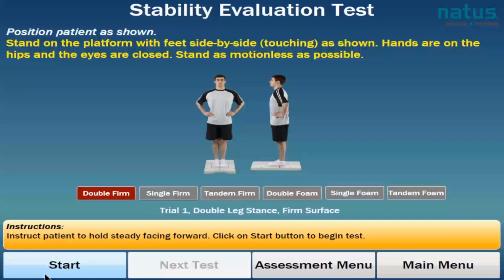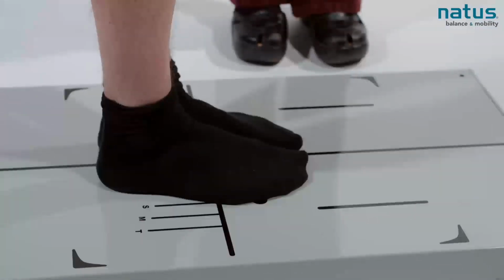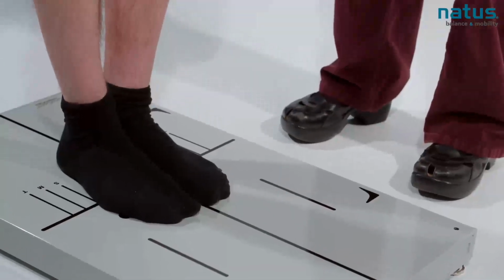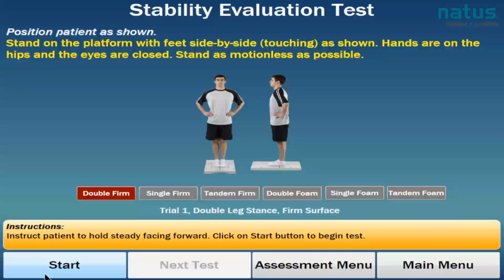And now we are ready to start the SET protocol. What I'd like you to do is stand right in the center of the force plate. And I'd like you to come a little more to the center. Great. Put your feet next to each other so they're touching. Great. For condition 1 of the SET protocol, we have the feet side by side touching so the base of support is narrow. I'd like you to put your hands on your hips, and this test is going to be performed with your eyes closed.